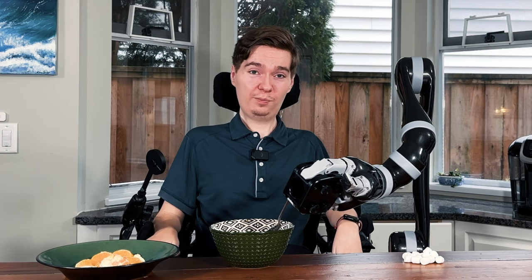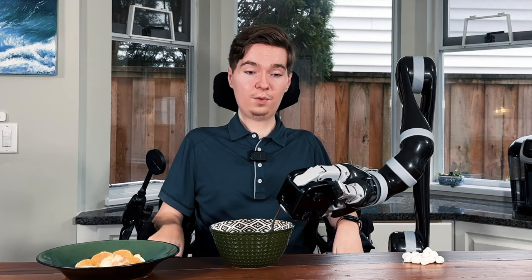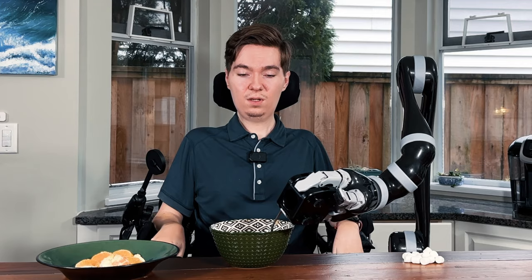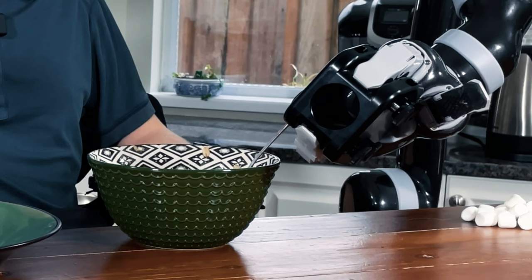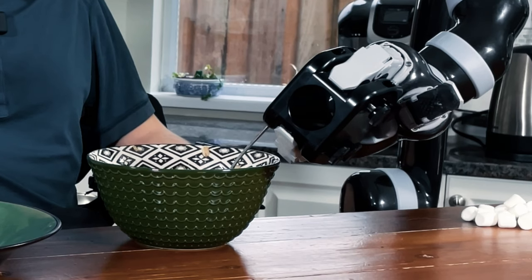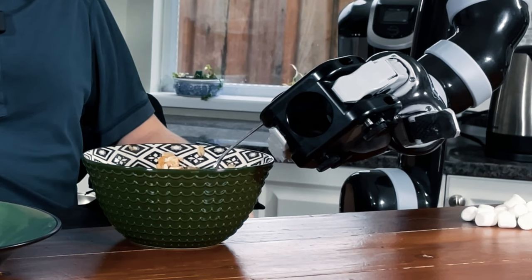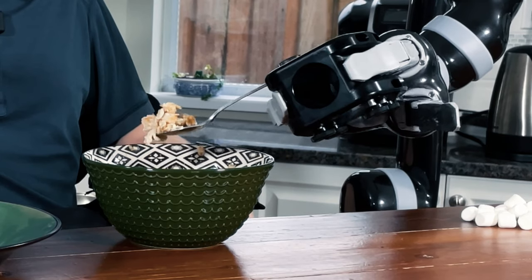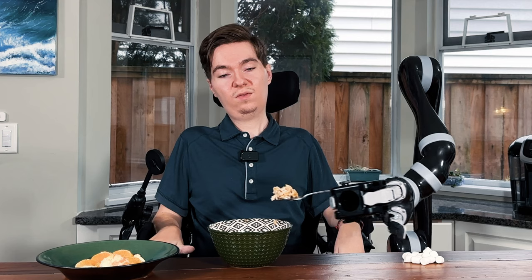In front of me I have some oatmeal — or it may be called porridge where you are — basically just some oats and milk, and it makes a great breakfast. So what I'm going to do is lower the utensil holder and with it the spoon. I'm going to go down a little bit and then rotate a little bit, and this is going to slide the spoon under the food and begin scooping. I'm in our B2 mode — if you're unsure about modes, make sure to check out our video on all the modes. I've got a good spoonful here.